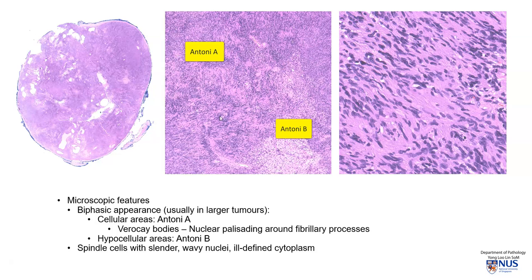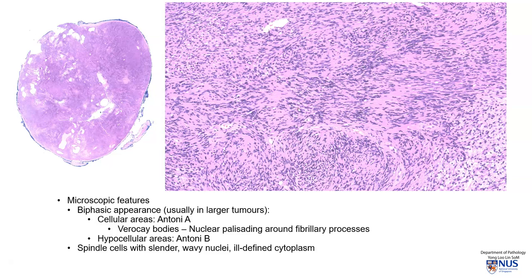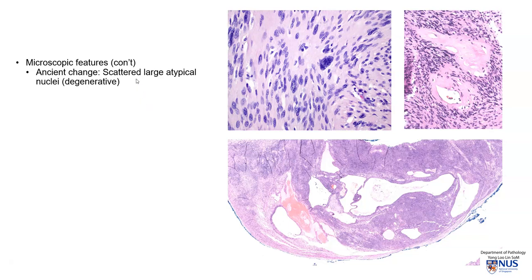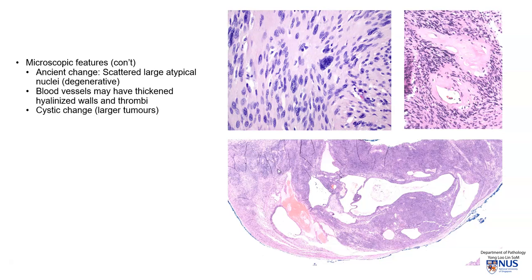Here again we can see the more cellular Antoni A areas with Verocay bodies, and the less cellular Antoni B areas. Schwannomas are composed of relatively uniform spindle cells with slender, wavy nuclei and ill-defined cytoplasm, with prominent nuclear palisading. Sometimes we may see ancient change — scattered, very large atypical-looking cells with huge nuclei and a degenerative, smudgy appearance to the chromatin; mitotic figures in these areas are very few. We also see blood vessels with thickened, glassy-looking hyalinized walls, sometimes containing small fibrin thrombi. Cystic change can also occur, as seen in this case.